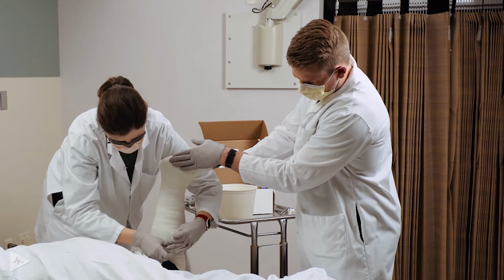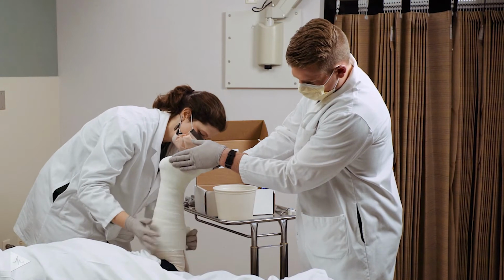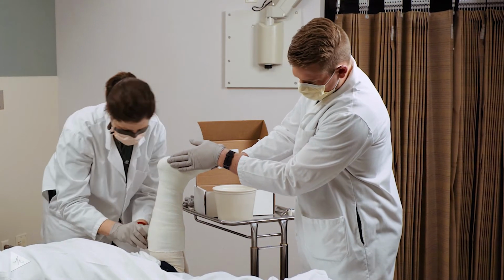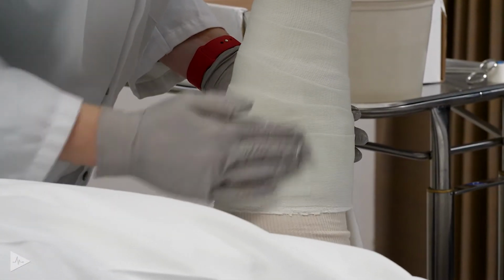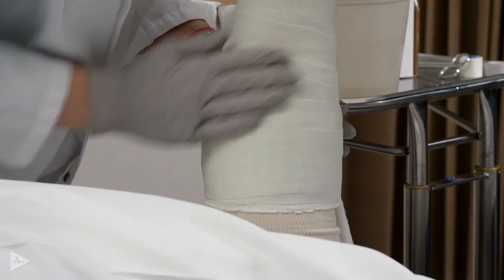And you want to bring that up to the same level as the first plaster layer. You can always get a little bit extra water, make sure that fiberglass is adhering to itself, give it a nice little rub to activate.